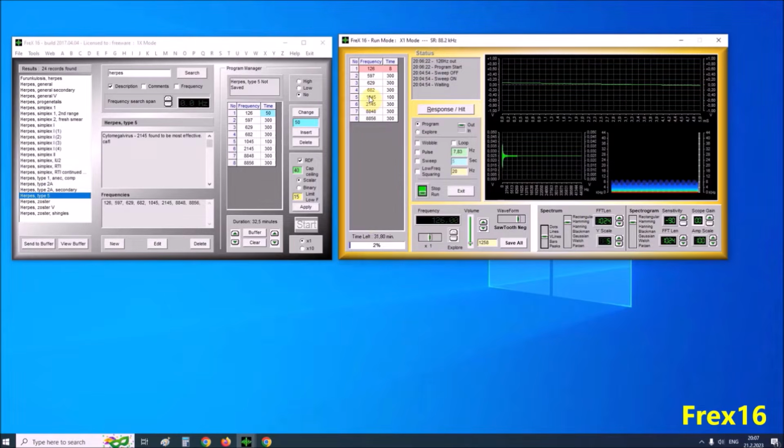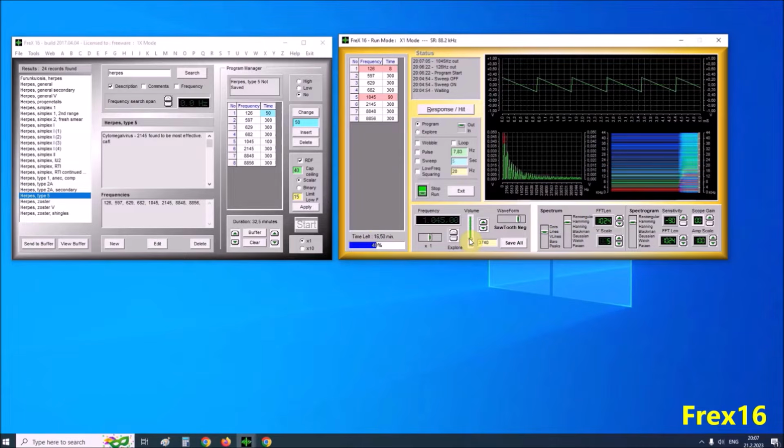Here we can choose another frequency, for example. In this case, this is the carrier signal with the harmonics and the amplitudes. So carrier and harmonics.